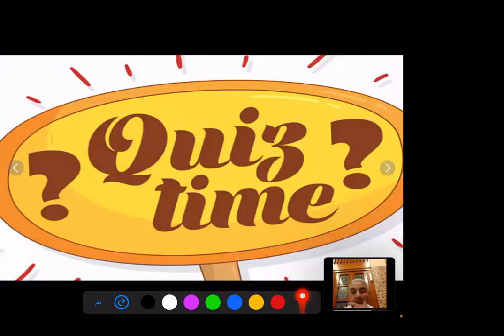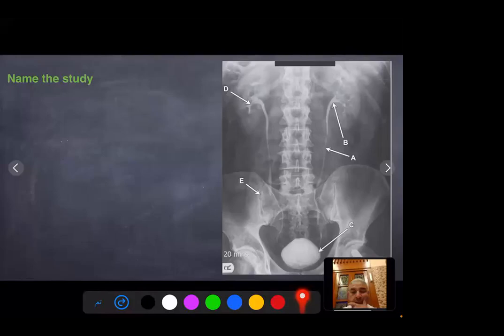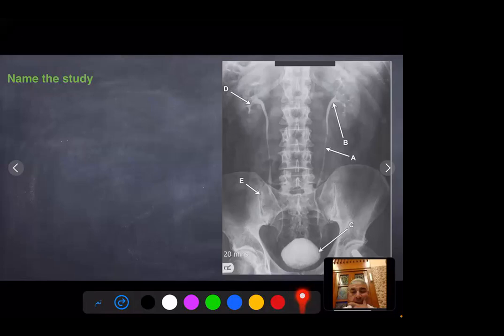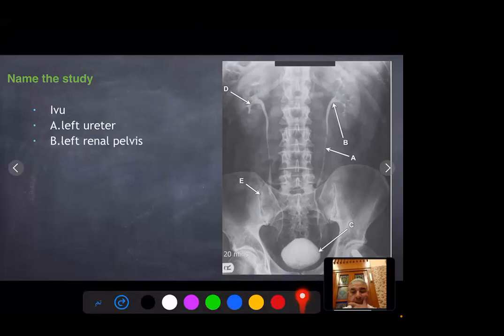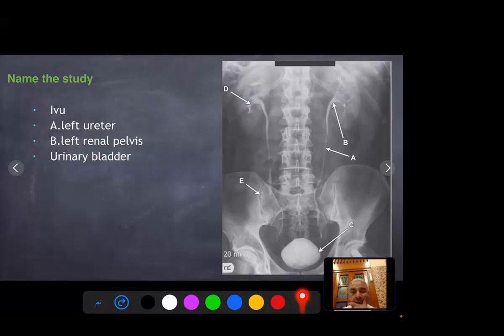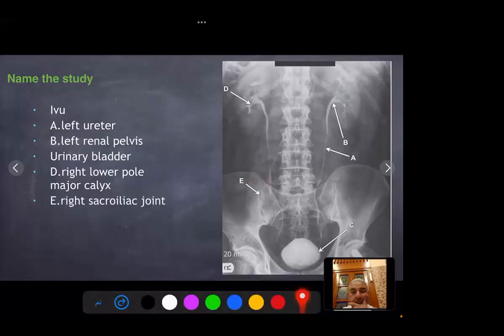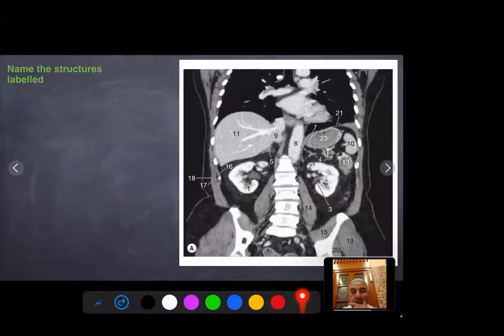End of lecture Q&A session: the instructor prompts students to name the study shown and identify labeled structures on an IVU image. Students identify the study as an IVU, label B as the left renal pelvis, label C as a major calyx, and label E as the sacroiliac joint. The instructor confirms these answers as correct and concludes the session.